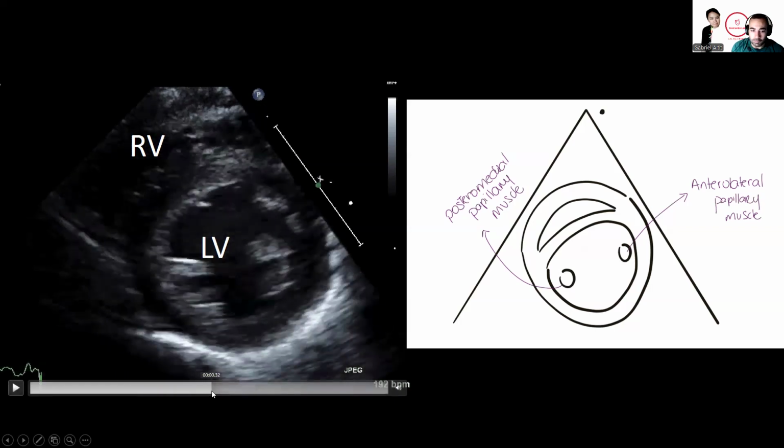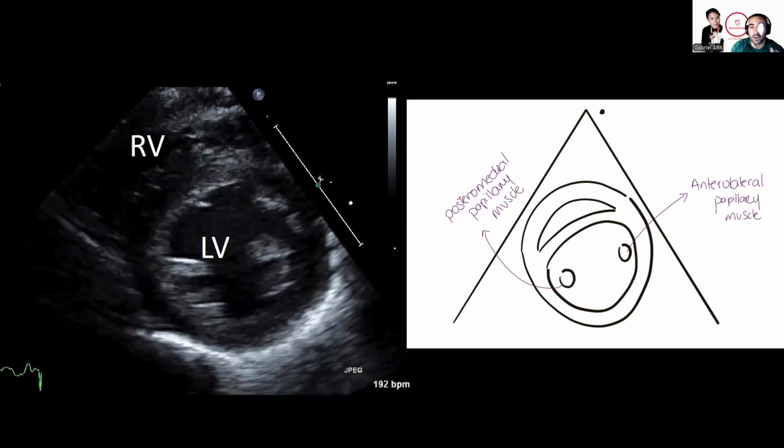In diastole, the aortic valve and pulmonary valve are closed. So the septal motion only informs you on the end diastolic pressure, and you would start seeing septal flattening if you have, for example, severe RV dysfunction where you get very high residual RV volume at the peak of diastole, or in situations where you get too much RV filling, such as vein of Galen malformation or hepatic AV malformation.